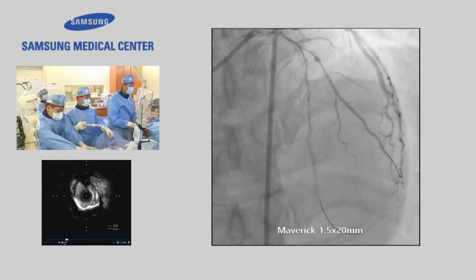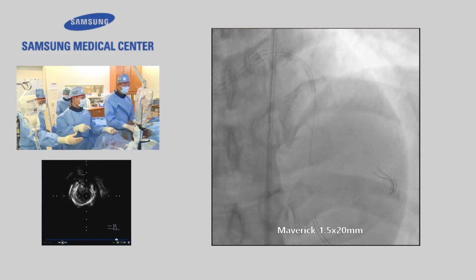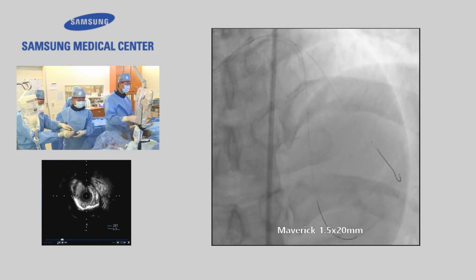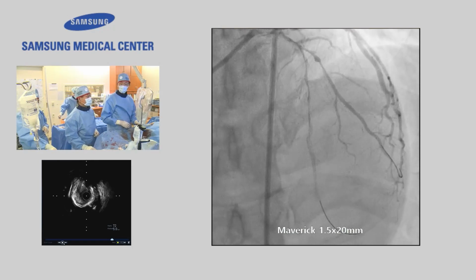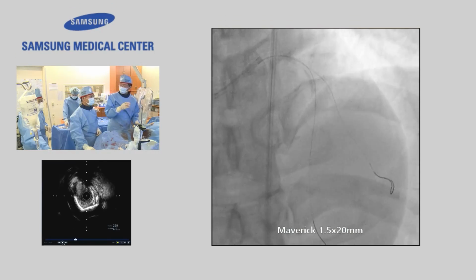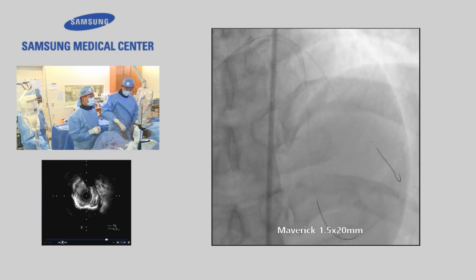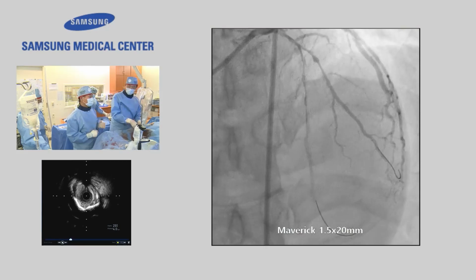Congratulations on your beautiful results. Actually, IVUS is determining the need for the two-stent technique here, because we see a lot of plaque up to the ostium. I would rather do IVUS. I like to dilate the LAD and the diagonal further and put the stent, then we can decide to stent or not. This is a provisional approach. It's a very important diagonal branch, and the wiring is very difficult. So I think the two-stent technique.